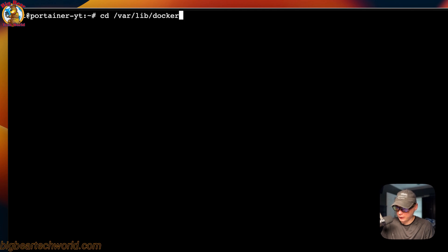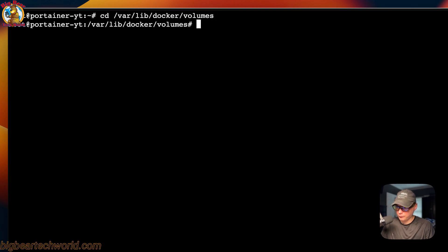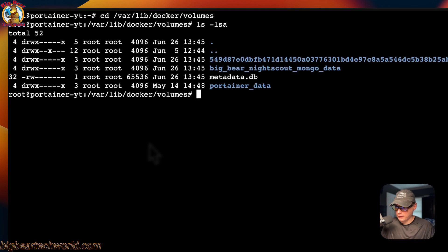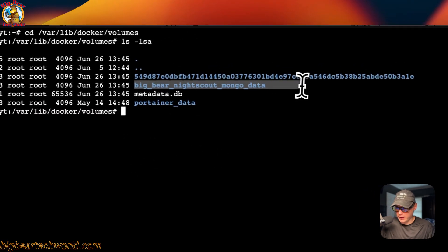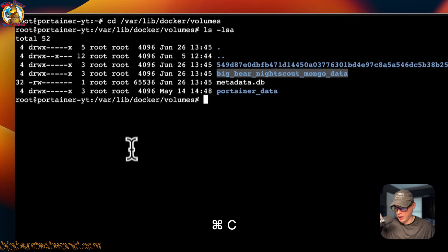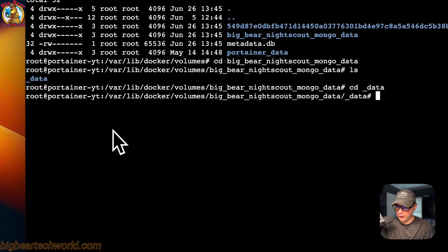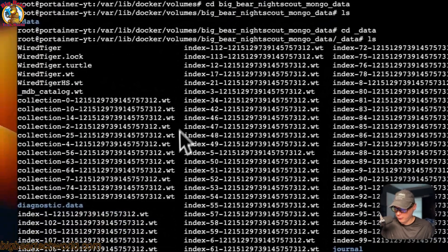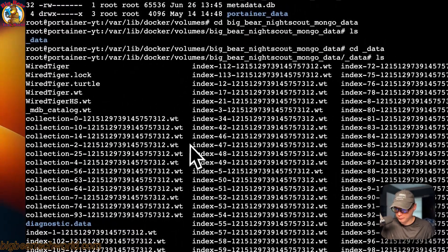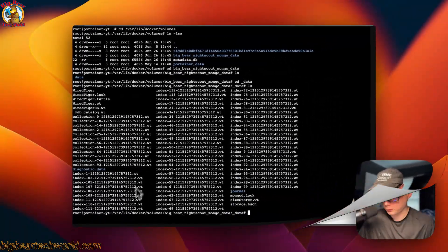Now I'm SSH'd into the server running Portainer to show you where the files are located. If you 'cd' into '/var/lib/docker/volumes' and run 'ls', you can see the volume right there. You can copy it, cd into it, go into the 'data' directory, and see all the MongoDB files — that's where your data is stored.